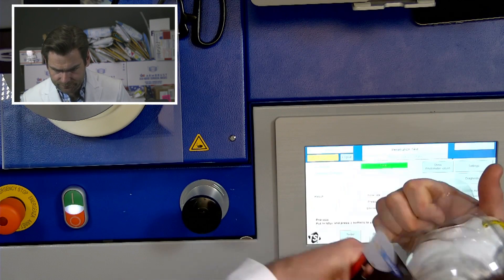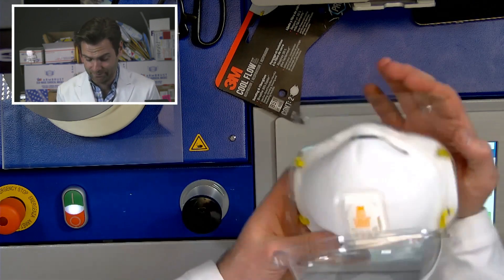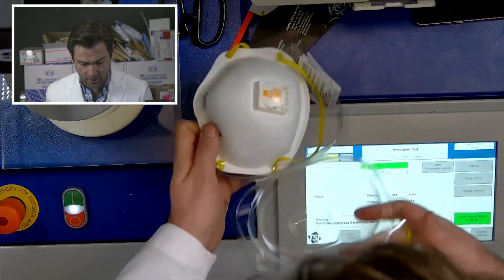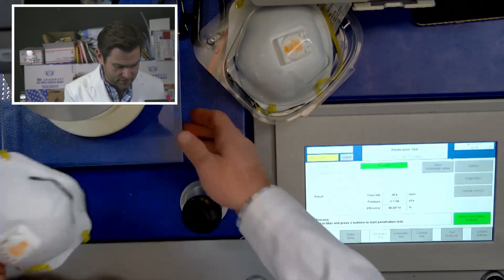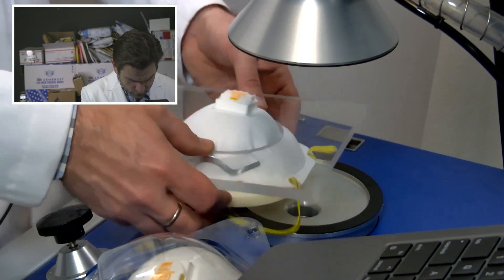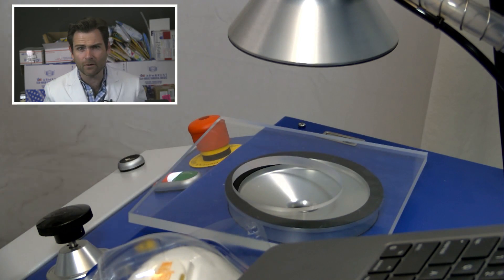Thanks Paulo, appreciate it. Does the new clamper have a name? It does have a name, thank you for asking. Let's get this in the clamp — I've got two so I can put one on my face and test this.